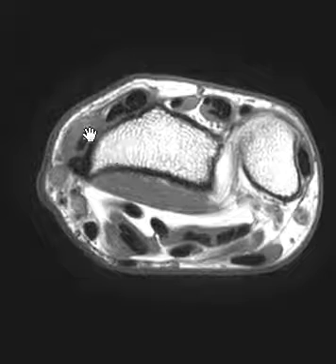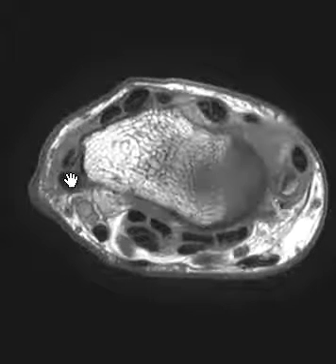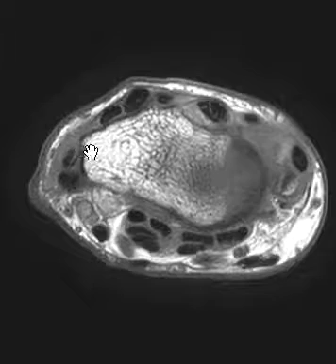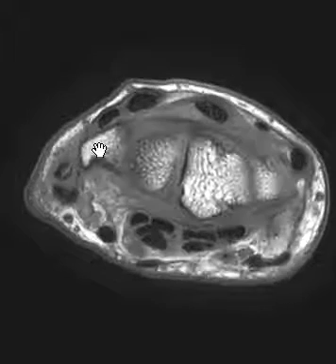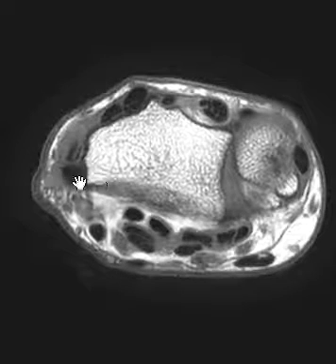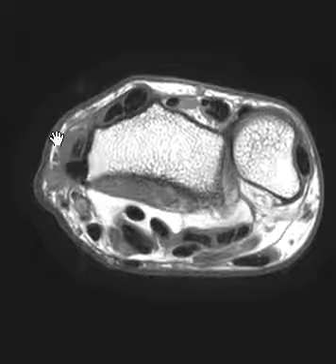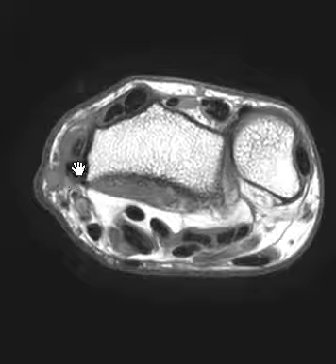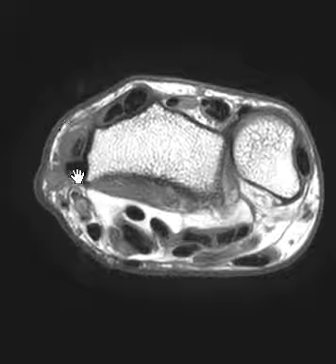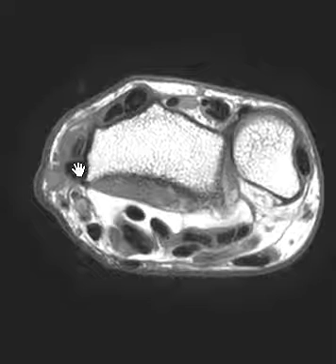But as we'll see here, he does have abnormal signal in one of these two tendons along the radial wrist. So I guess this still would fall into the category of Quervain's. And so here we go. There are two tendons along the radial aspect of the wrist we're going to look at here. This is the radius, this is the radial margin here, and we see two tendons in the first compartment here. One of them is the abductor pollicis longus. APL looks nice and dark and uniform, looks just about right here.